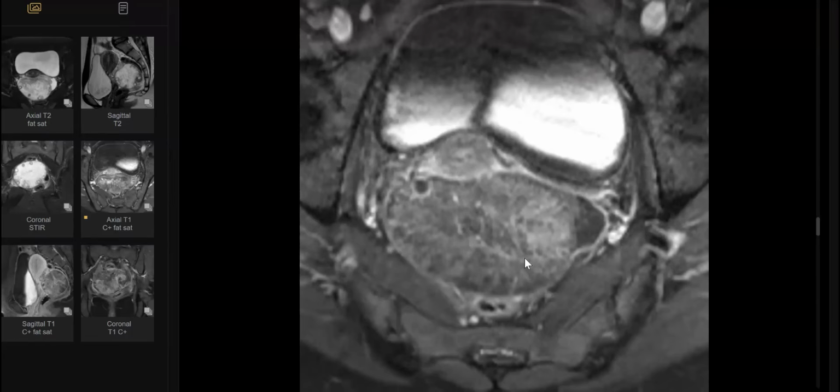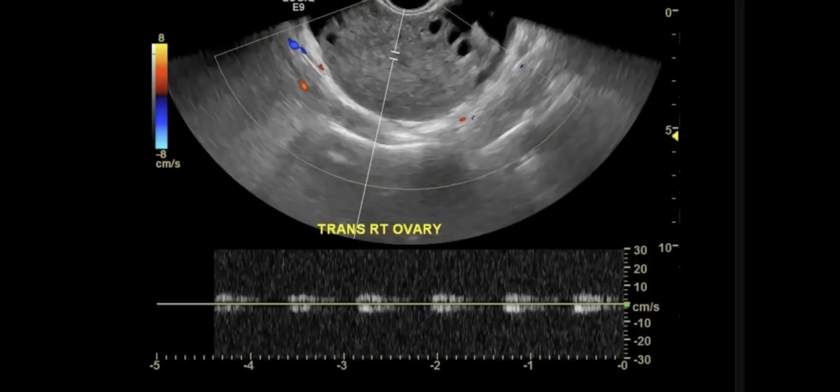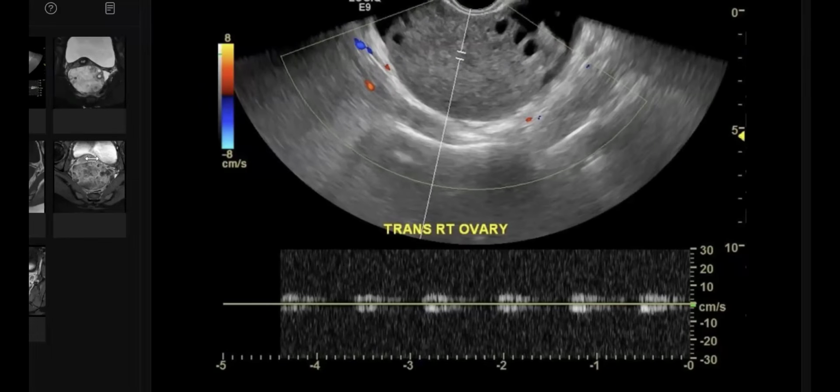Assuming I gave you ultrasound study, not just a minute. I'll take the mouse, and I'll answer the case at the end. Can you comment on ultrasound also? You can scroll. So this is transvaginal ultrasound. It's not scrolling, it's a static image. I will refresh. No problem. The image is fixed on MRI.